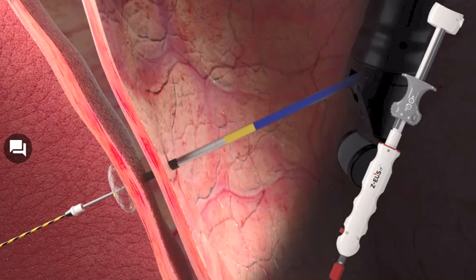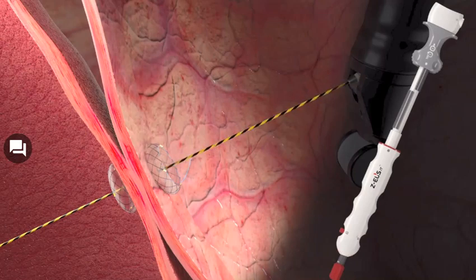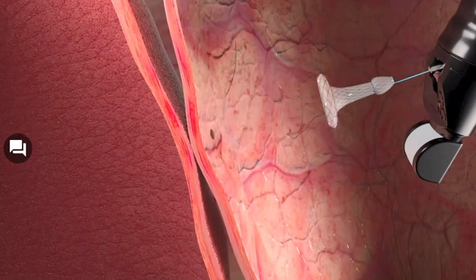To deploy the proximal flange, rotate the spin lock 180 degrees again. Deployment is ready when you see even numbers of stent deployment indicators. Push it all the way upwards. Check that the stent is properly positioned. Unlock the luer lock counterclockwise and remove Z-EUS IT. To remove the stent, pull the lasso on the stent by using alligator forceps or snare.